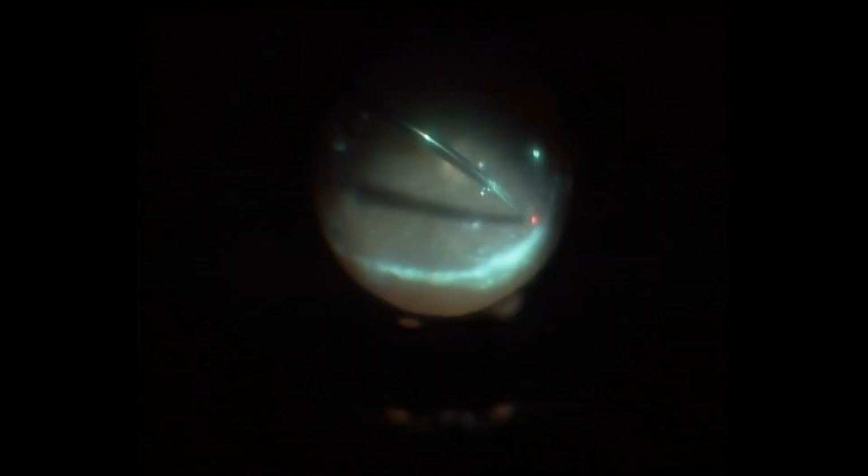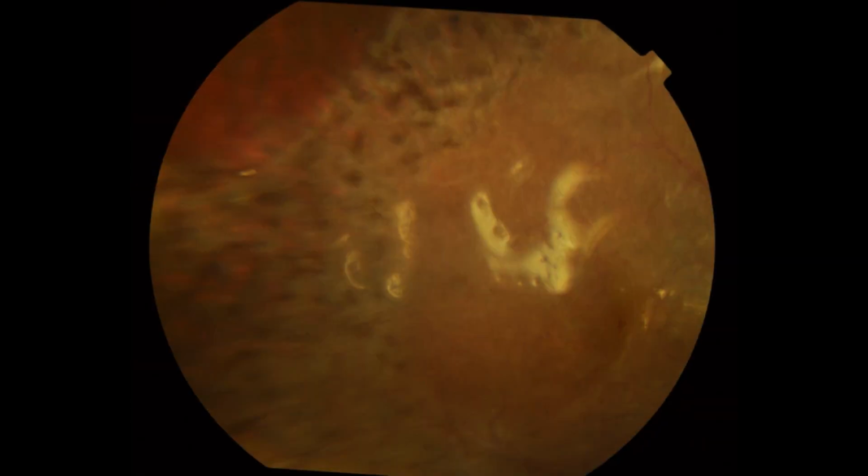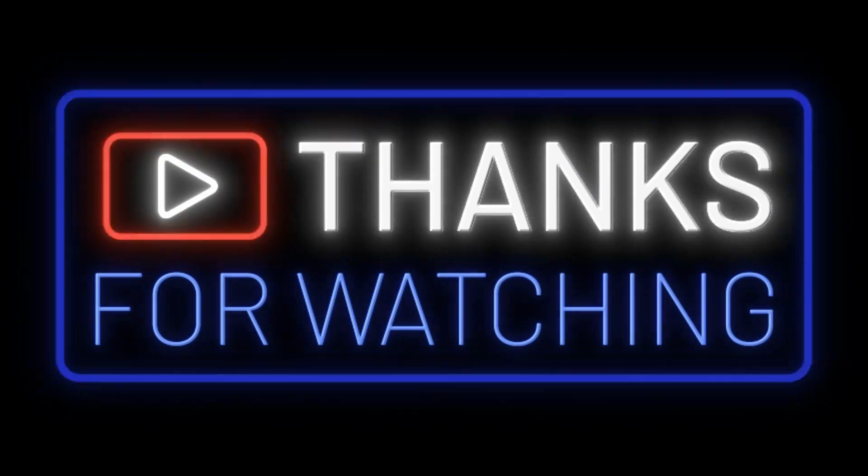Once the retina was flattened, a 360 degrees endolaser was completed. And finally, a PFCL oil exchange was done. The retina was successfully attached at 3 months of follow-up with best corrected visual acuity of 3/60.